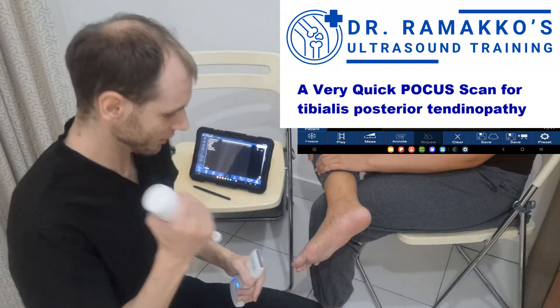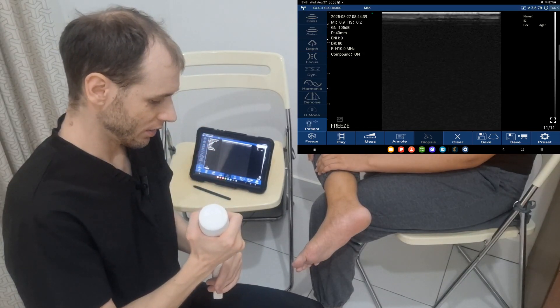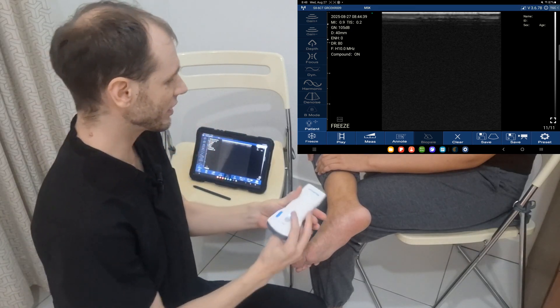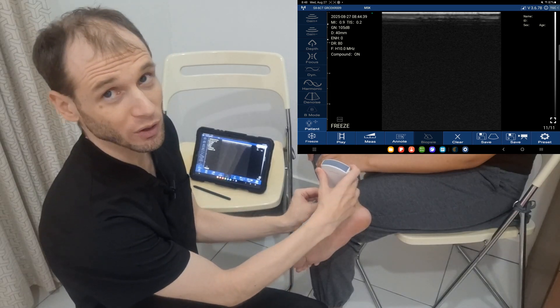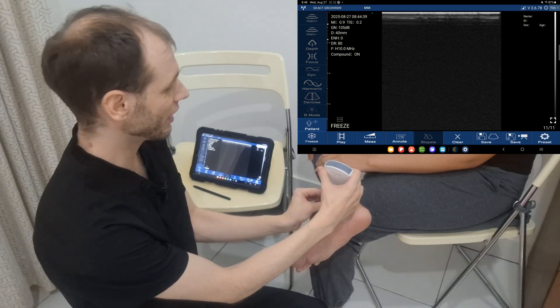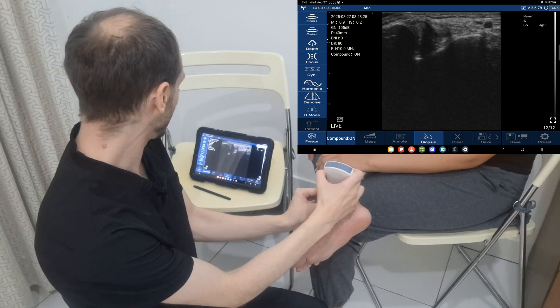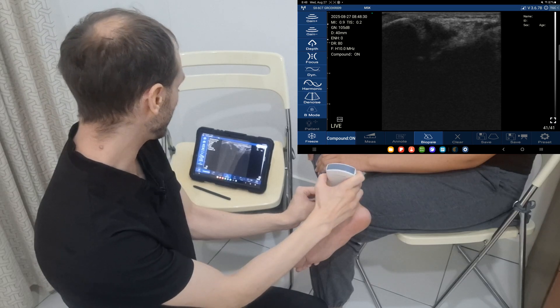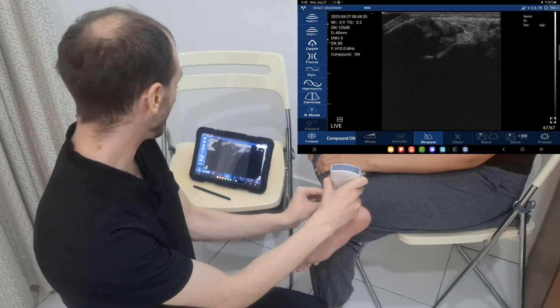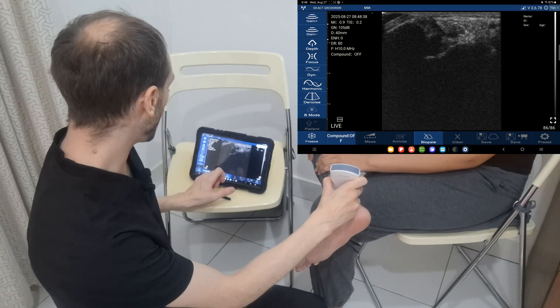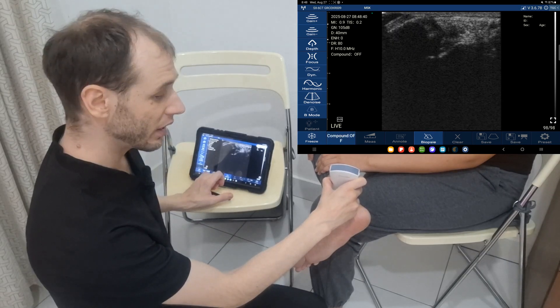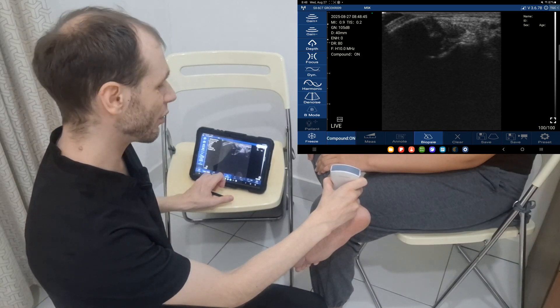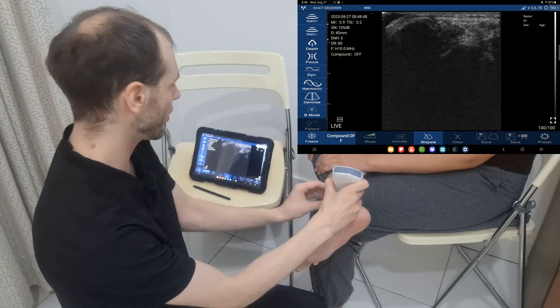We'll need some gel here. This is a shallow structure so I'm using high frequency — this goes up to 10 megahertz. This is a structure you're going to want to evaluate both in short axis and long axis. You will have to manipulate your transducer a lot so that you can actually see the tendon, because there's going to be a lot of anisotropy. You can turn compound imaging on or off — off gives you a better frame rate, on gives you better pictures, so keep switching as needed.